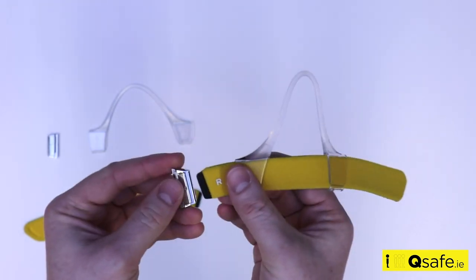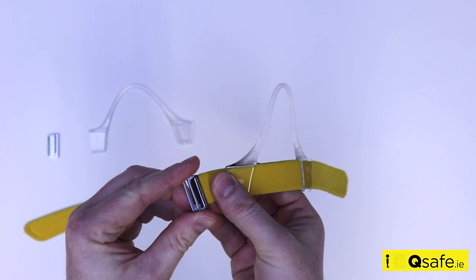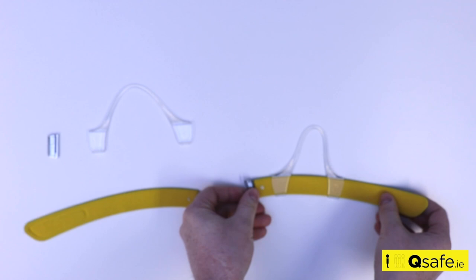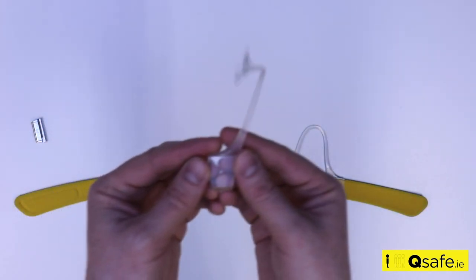Fully insert the black plastic gripper end of the headband strap into the silver clasp and close firmly. Then reassemble the left headband.